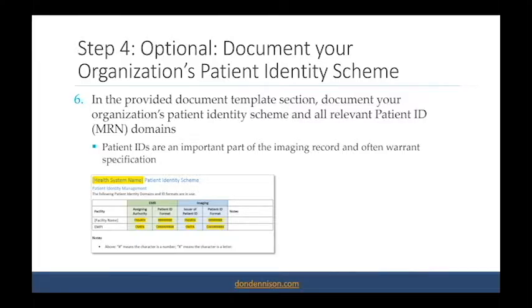You may find that the assigning authority is actually being coerced somehow into the issuer patient ID, or within imaging at that facility, the issuer of patient ID is not being used. So this allows you to just kind of create a master table for convenience of how patient IDs are being managed.